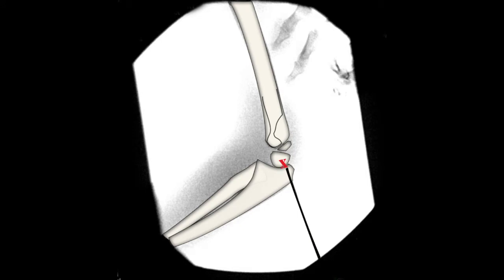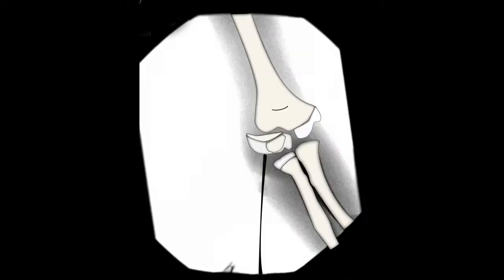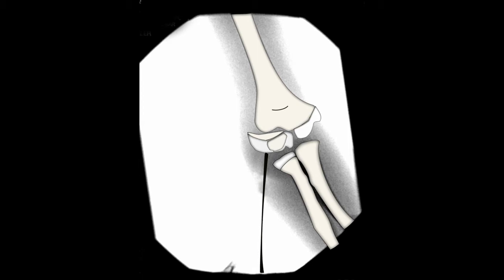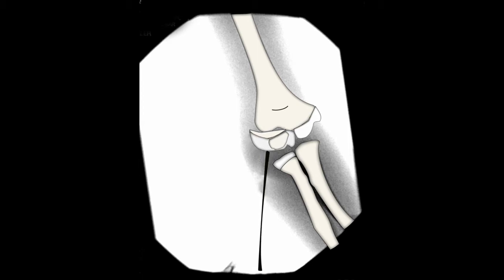The guide pin is positioned appropriately on the lateral condyle and used to manipulate the fracture into position. Usually some gap remains at the fracture site.